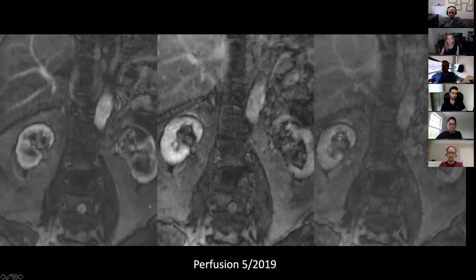I will be talking about perfusion imaging, but just to give you an idea, we're trying to do this on most of our patients now, and this is a dynamic scan that we do. It's an early arterial phase, mid arteriovenous phase, and this is a delayed phase. So whatever enhances early on in the arterial phase is always sinister. And you can see the new metastasis is enhancing quite a bit, but we really do not see any enhancement in the treated vertebra. So as I said, the patient did very well, and he's continuing to do so.